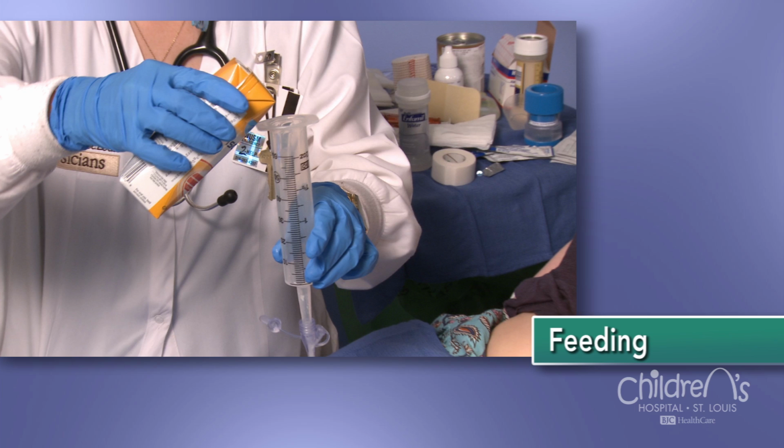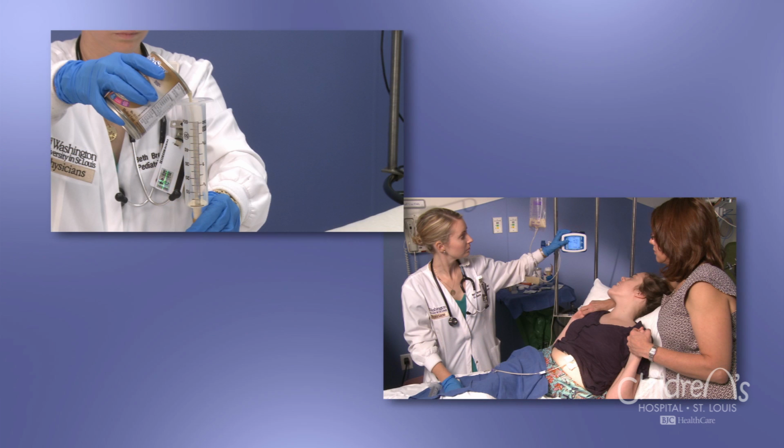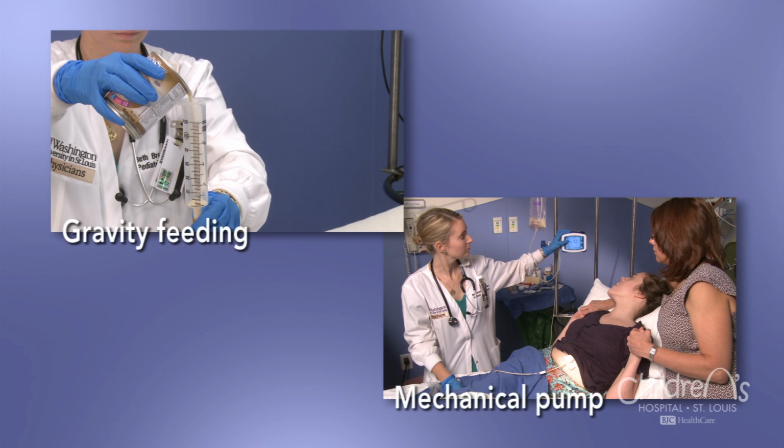Before your child goes home, you will be given instructions about a diet and feeding schedule that deliver the calories and fluids your child needs. There are 2 forms of feedings. One form of feeding is done using gravity. The other uses a mechanical feeding pump. We'll cover each of these in a few moments. But first, some general guidelines.